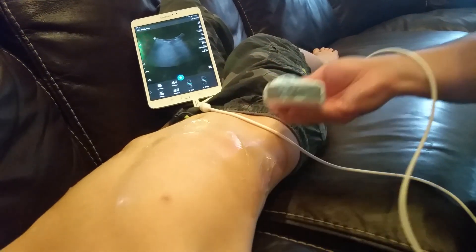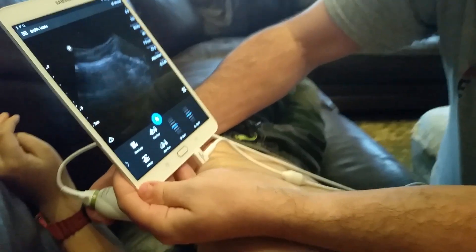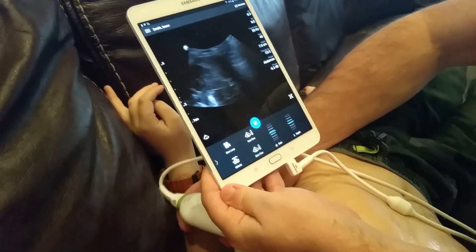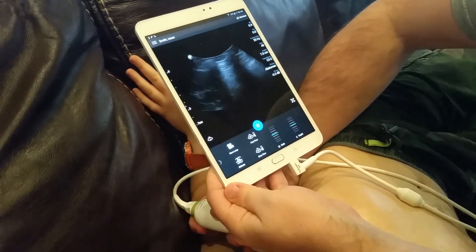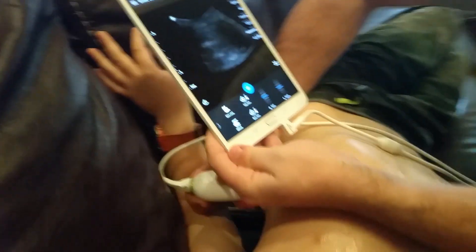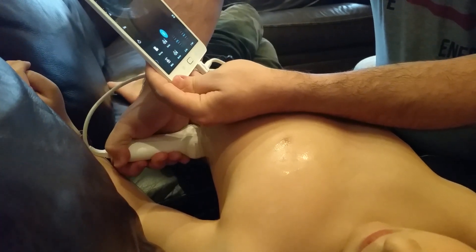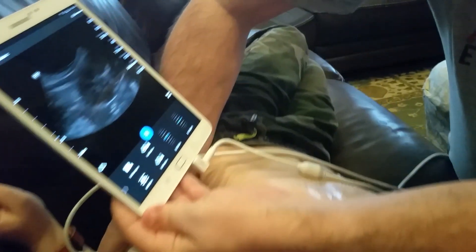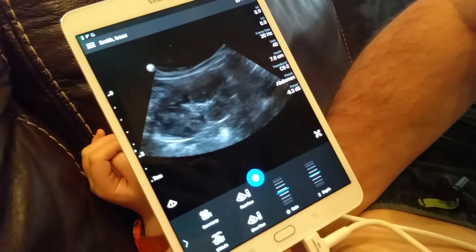To see the left kidney, have the patient roll towards you. This one is a little harder to see — there's more stuff in the way, including the spleen, which doesn't provide as good an acoustic window. You typically have to go a little more posterior. There's a good view of the left kidney, and I don't see any hydronephrosis.